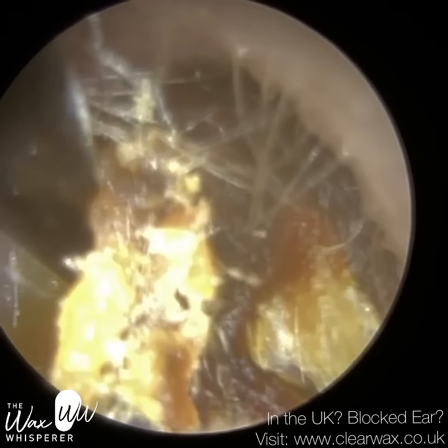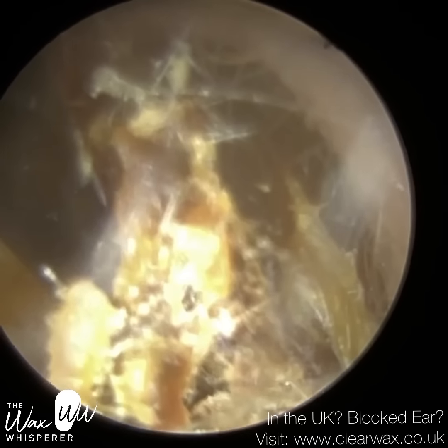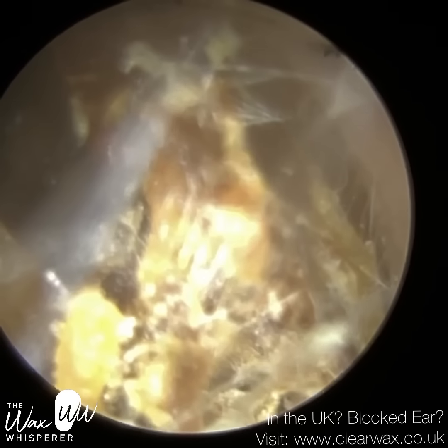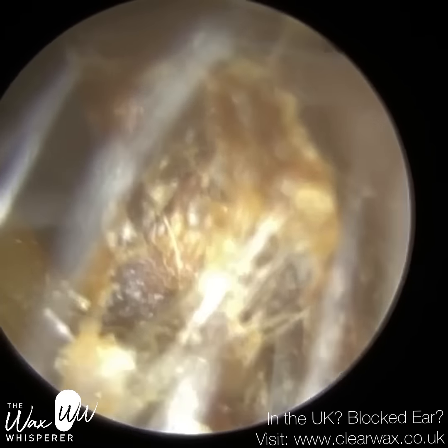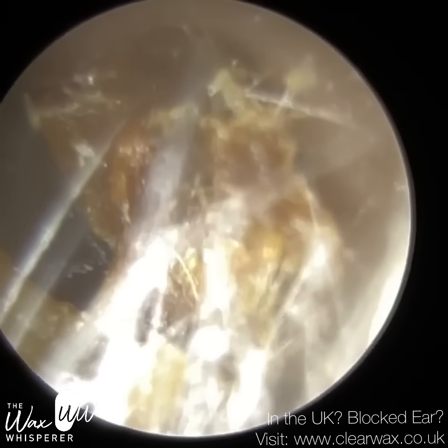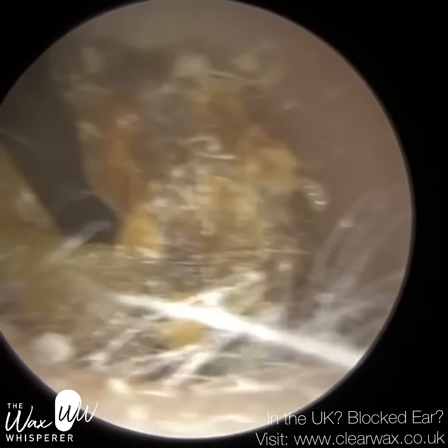And then you can see how I've glided it in and behind, and slowly but surely I'm going to come away. If I came away too quick with the hook, I think the hook would have just dissected this plug. It would have just cut through it. So I'm just using a measured approach, just being patient, slowly bringing this forwards and out of the ear.